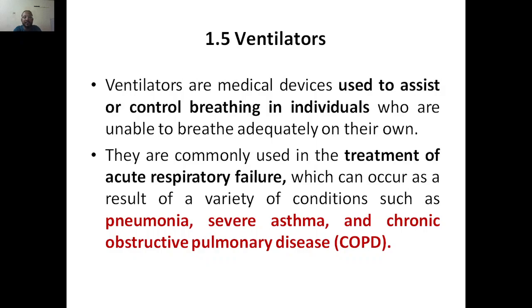Okay, so ventilators are nothing but what? Medical devices used to assist or control the breathing in individuals who are unable to breathe adequately on their own. Adequately in the sense normally. Okay, so next, they are commonly used in the treatment of acute respiratory failure.